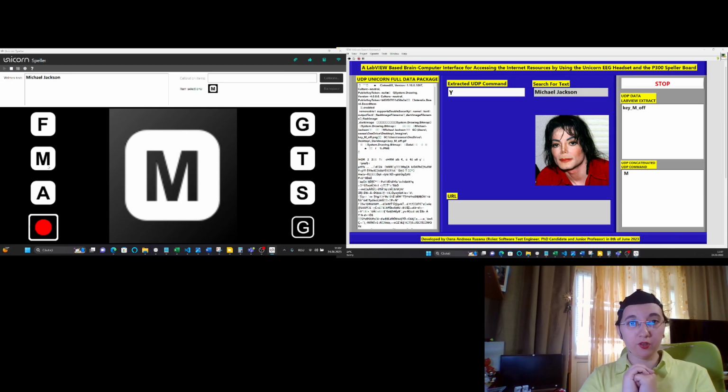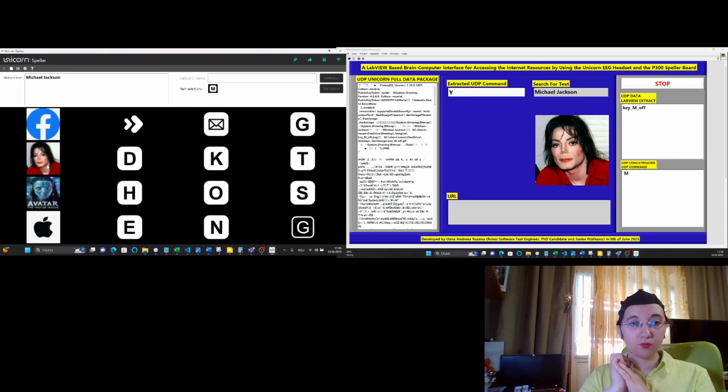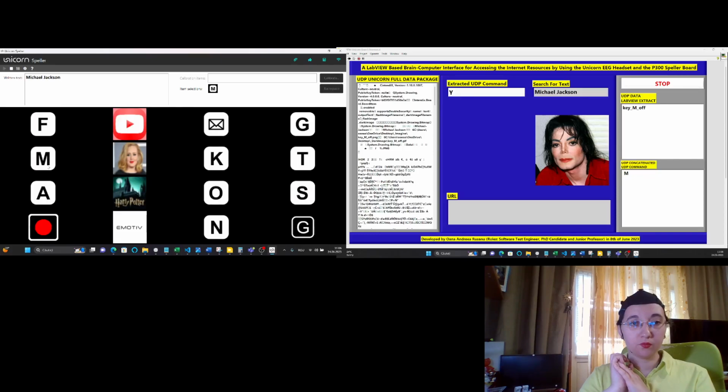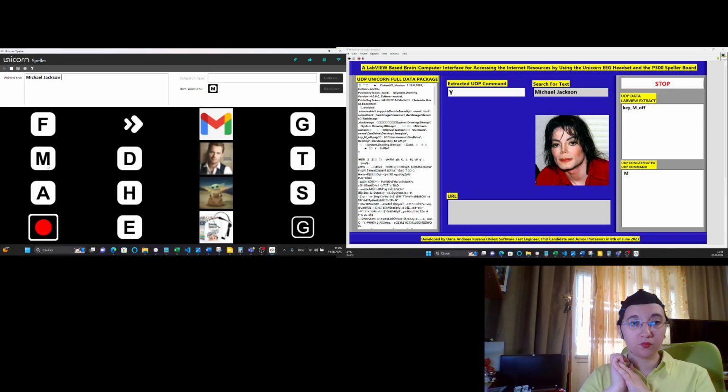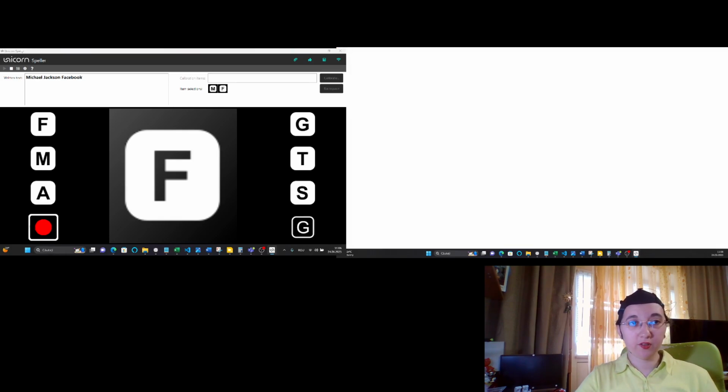So Michael Jackson was selected. You can see that I didn't use my hands. Now Facebook was correctly selected.